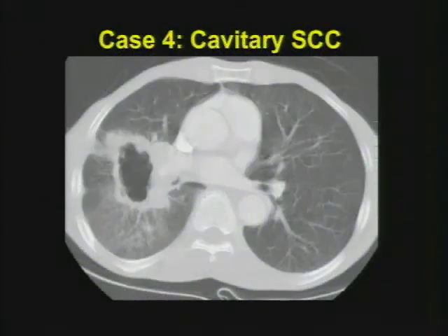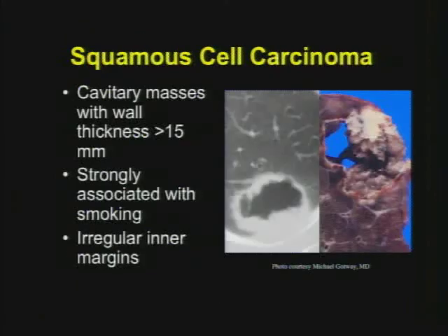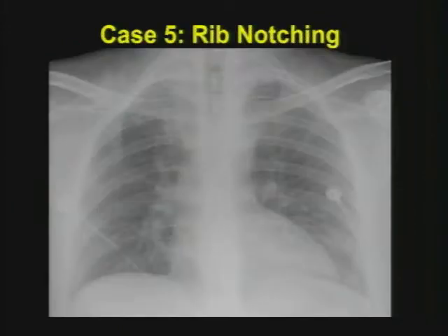Case number four: simply showing another cavitary squamous cell carcinoma. They don't always have to be juxtahilar or near the mediastinum, but they very often are. They have very thick, irregular walls — particularly with fungating margins. You should really be thinking squamous cell carcinoma over lung abscess. Greater than 15 millimeters in wall thickness, association with smoking — you know the drill.